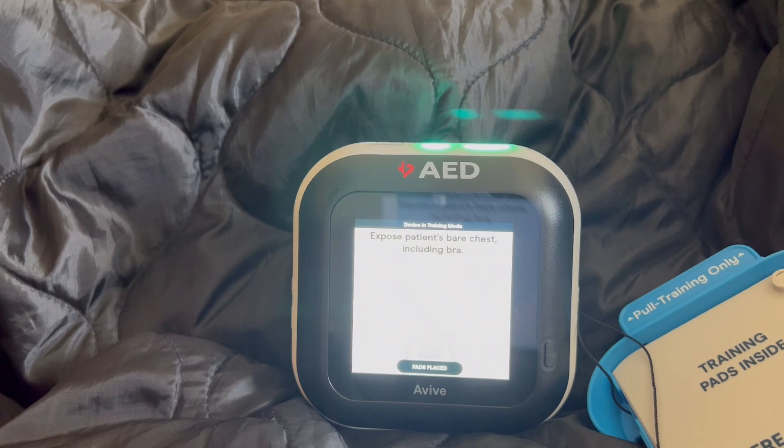Expose the patient's bare chest, including bra. Once the patient's chest is exposed, peel open the package you pulled from the device and take out the pads inside. Look at the picture on the red pad. Peel off the red pad from the white liner and firmly stick on the patient's bare skin, exactly as shown. Peel off the blue pad from the white liner and firmly stick on the patient's bare skin, exactly as shown.